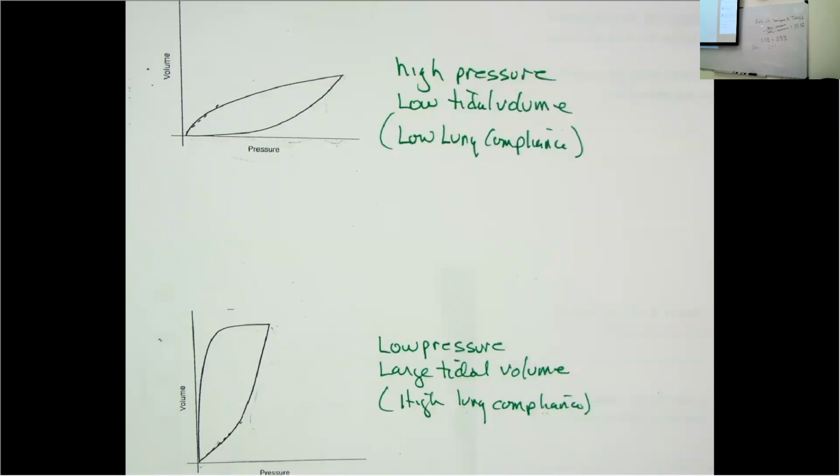Here they're hardly having to apply any pressure when they breathe in. They're just breathing in and the volume's shooting way up, so their lungs are very compliant, they're expanding super easy. This is the first time that I've been lost. Sometimes she explains it weirdly, and it's simple, but I have to look back in my notes to see what causes that.